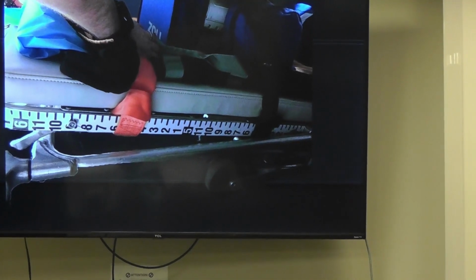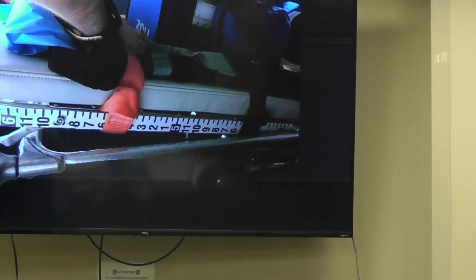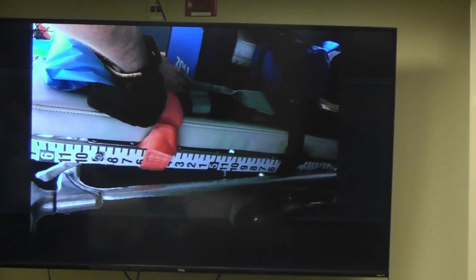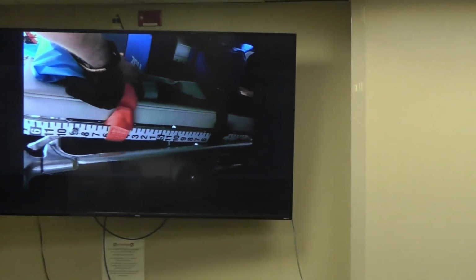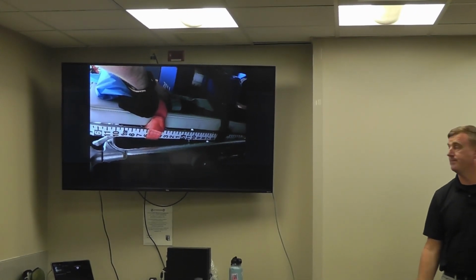But this is the 7-Eleven door frame measurer thing, right? You walk out of 7-Eleven, that's what's on the door jamb next to you. We ordered it from Amazon, measured from the head of the stretcher down to the rail, and then stretched it down from there. Drag your patient to the head of the stretcher, you get a rough height on them, okay?